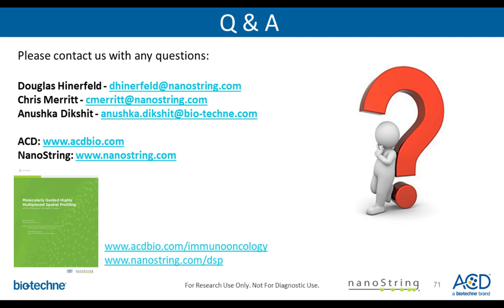Great, thank you. All right, next question. Can DSP RNAscope be used to detect mRNA or DNA with a hotspot gene mutation in a specific cell type in a tissue section? So maybe I'll go ahead. Sorry, go ahead, Doug. Okay, I was just going to say that if you can fluoresce the target of interest using, in this case, RNAscope, then we can use that to guide the cells in which we analyze with DSP.